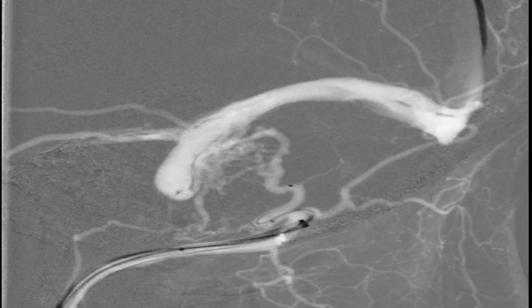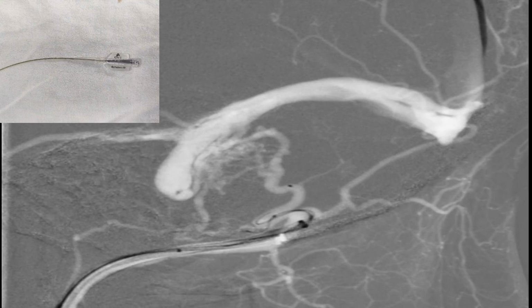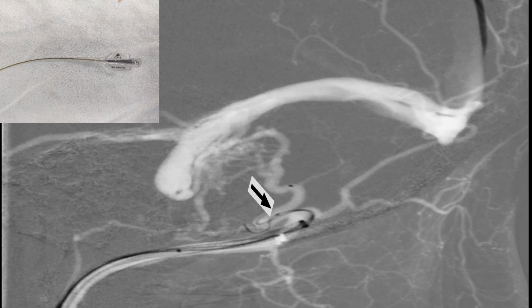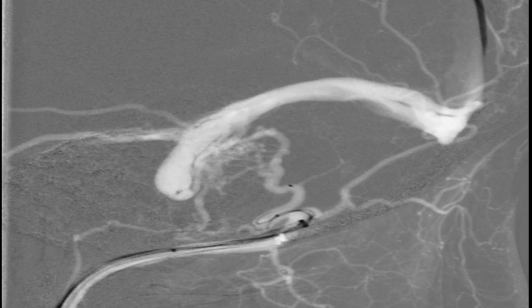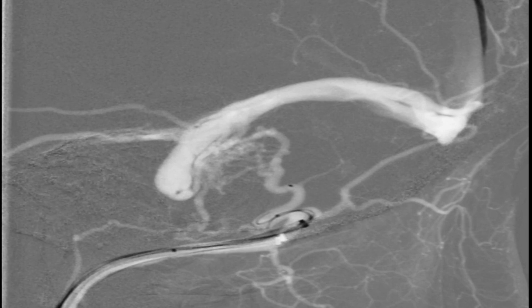A 150 cm Echelon 10 microcatheter was then taken and advanced over a 200 cm Synchro microguide wire and the tip of the microcatheter was placed in the same feeder branch of the left occipital artery but proximal to the tip of the Apollo Onyx Delivery microcatheter. The Echelon 10 microcatheter was chosen as it is DMSO compatible and can be used both for deploying the microcoils as well as injecting the Onyx.